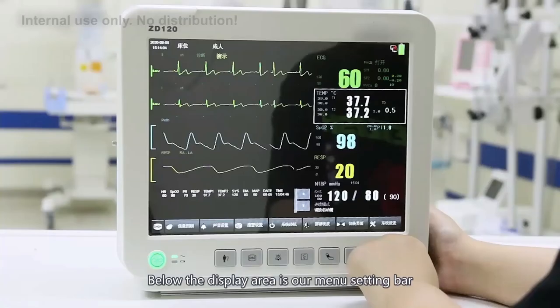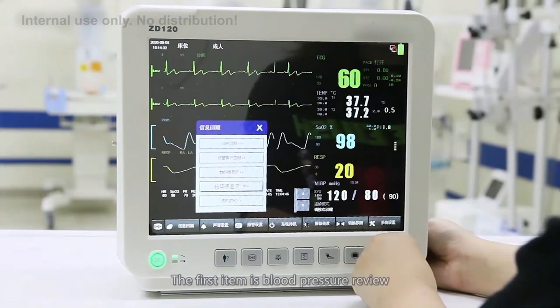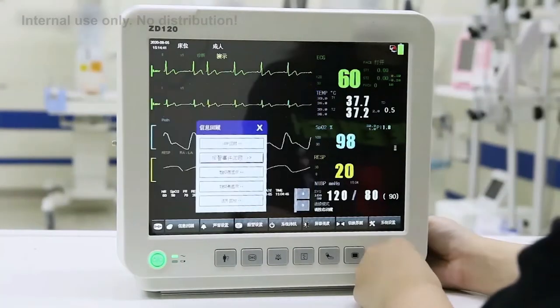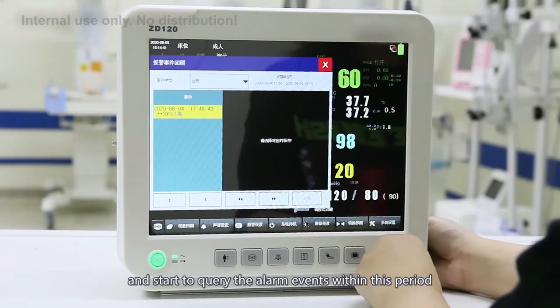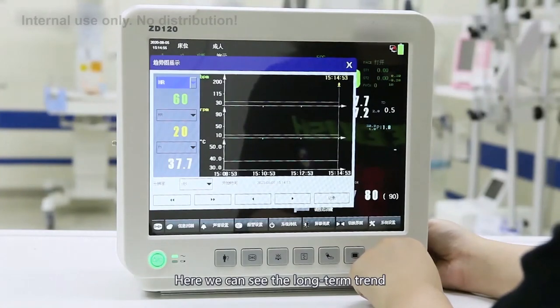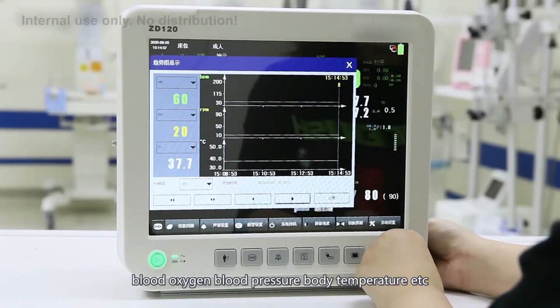Manual interface introduction. Below the display area is the manual setting bar. The first item is the information review, which has five sub-items. The first is blood pressure review, where you can revisit historic blood pressure measurements. The second is a review of alarm events — select a time period and query the alarm events within it. The third is the trend graph review, where you can see long-term trend changes of all parameters such as heart rate, respiration rate, body temperature, ST segment, blood oxygen, blood pressure, and more.